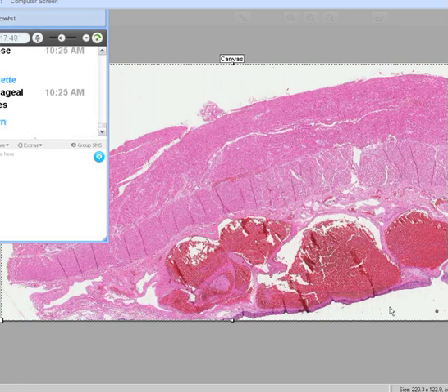So let me ask you this. What major organ of this body is probably shot? Kidney, liver, brain, pancreas, gallbladder. Of course, this is varices of the esophagus going hand in hand with hepatic cirrhosis.